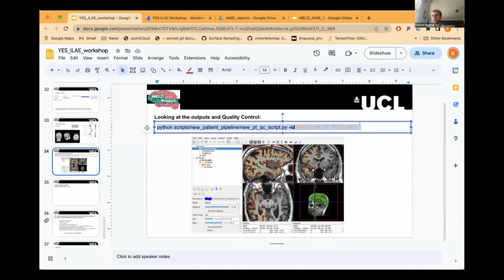consistencies. So maybe one lesson from this example is that if you run it on a few of your patients, you might start to see patterns of things that are being picked up as false positives. And I guess that's partly just to do with the variability of scanners that we haven't been able to completely account for. But that's a great question.